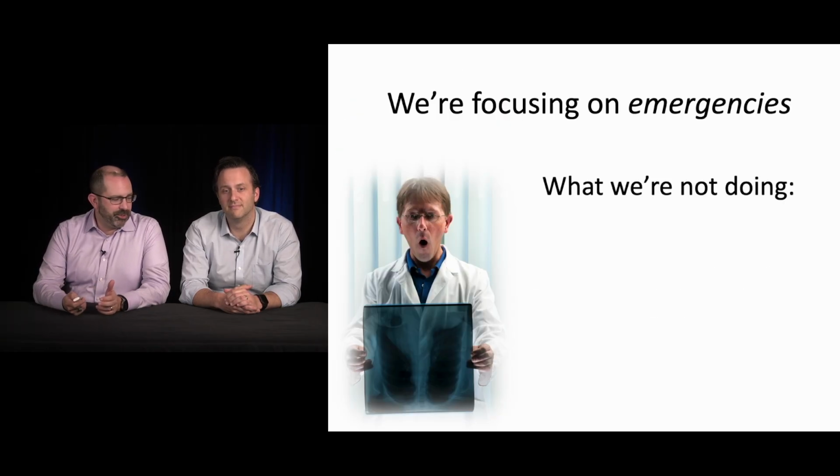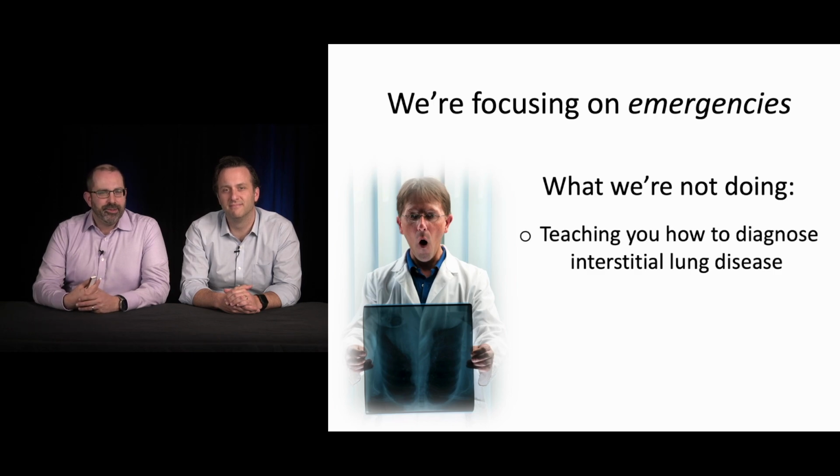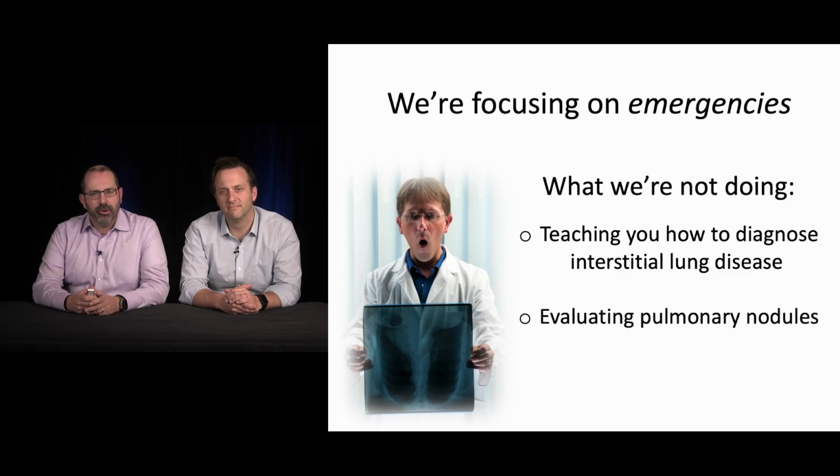What we're not going to be doing is focusing on teaching you how to diagnose interstitial lung disease. We're not going to talk about evaluating pulmonary nodules. We're really focusing on the big, bad, scary things here. The stuff you need to know before the read comes back. Exactly, like when to hit the panic button.